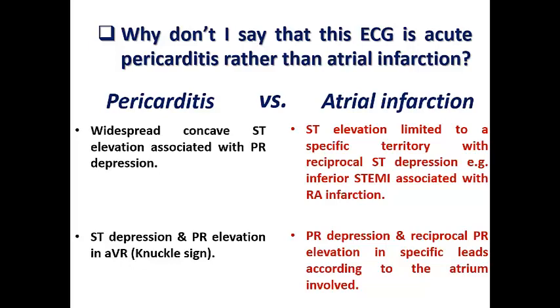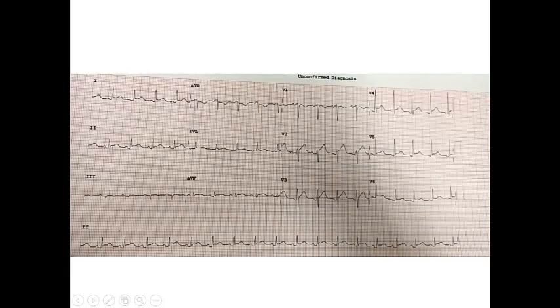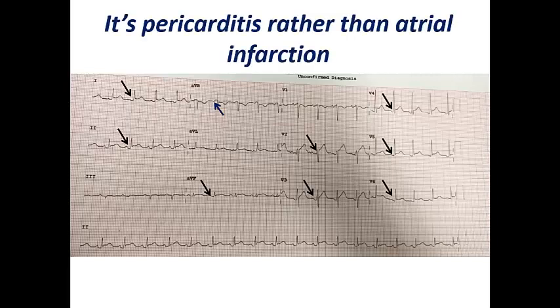For example, in inferior STEMI with right atrial infarction, I would see PR depression in leads II, III, and aVF, and PR elevation in leads I, aVL, and possibly V1 and aVR. The changes of ST and PR segments in atrial infarction are not widespread as in acute pericarditis; they are limited to a specific territory. Let's see this ECG example: we see widespread PR segment depression in leads I, II, aVF, and V2 to V6, associated with widespread ST elevation and the knuckle sign — PR elevation and ST depression in aVR and slightly V1 — indicating pericarditis rather than atrial infarction.